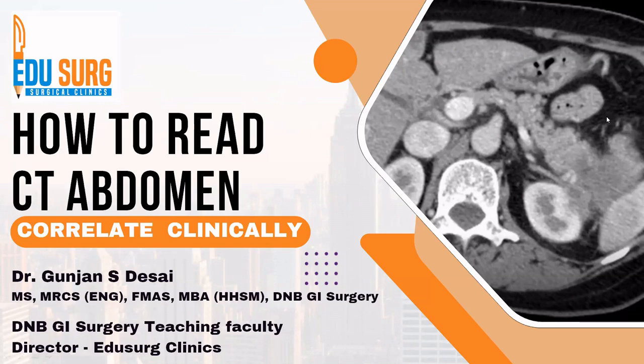I am Dr. Gunjan Desai and today we are going to discuss a very basic but very practical topic that was being asked by a lot of students, and that is how we read a CT abdomen.